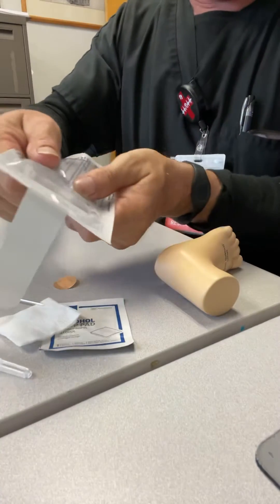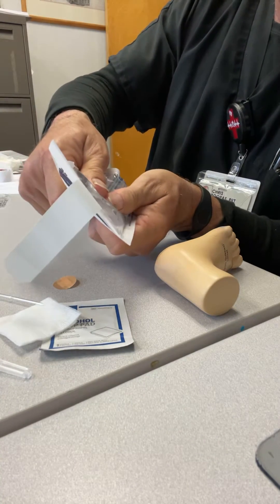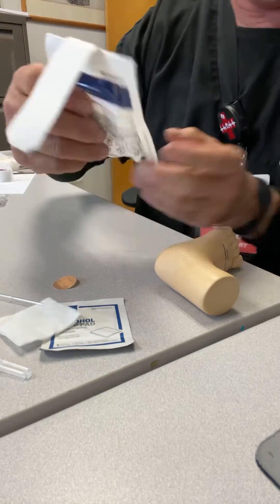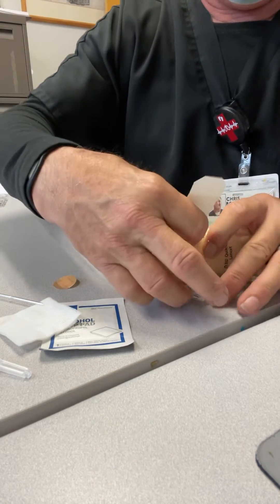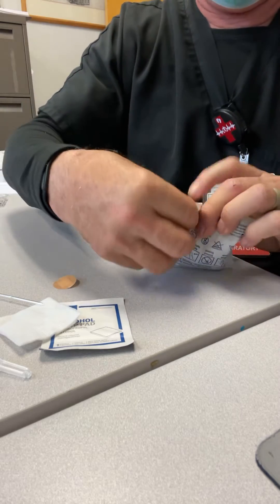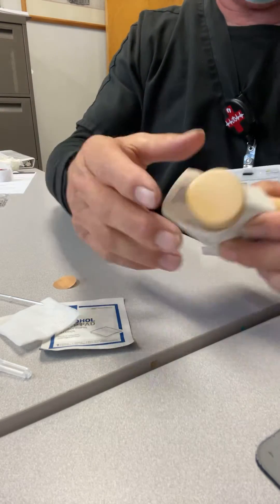You just squeeze — squeeze this really hard and it will bust up and get warm. Get the baby's heel and wrap it around just like that and let it warm.